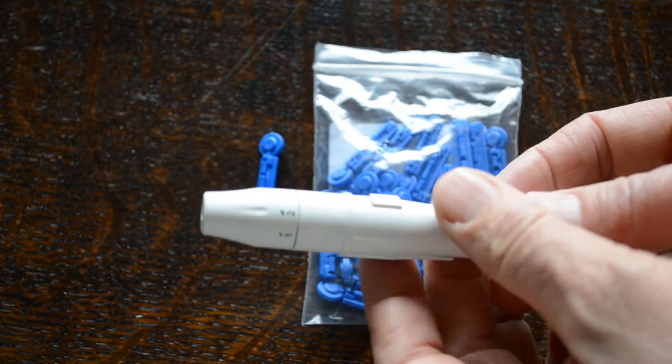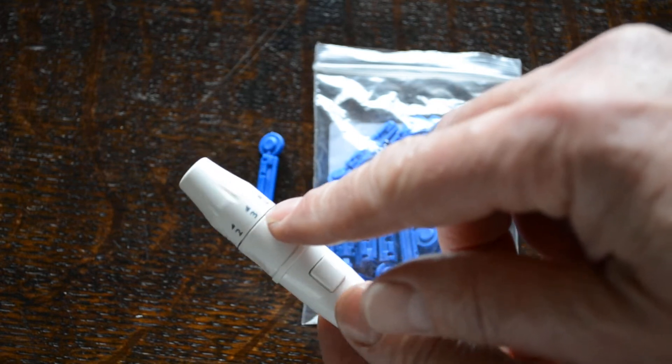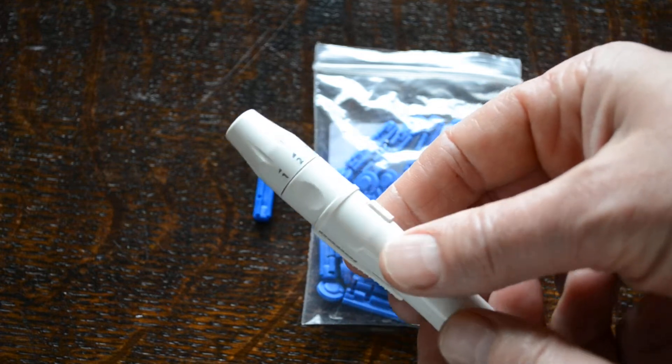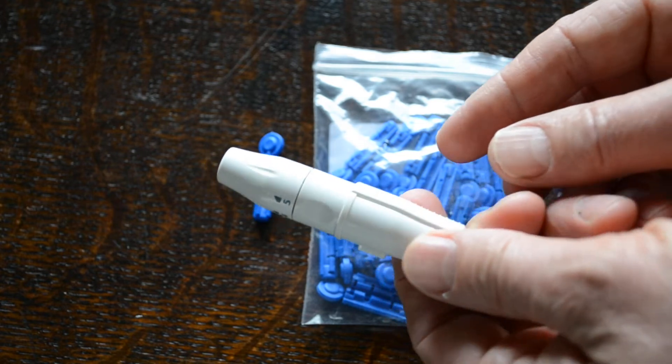These are the auto-lancing devices and you'll see on this end you can automatically set the depth of the lancing from one through to five. That is something that you have to experiment with to find the correct depth that gives you a good lance.